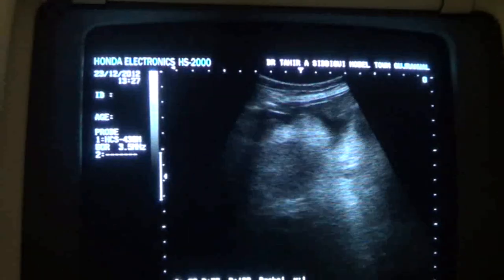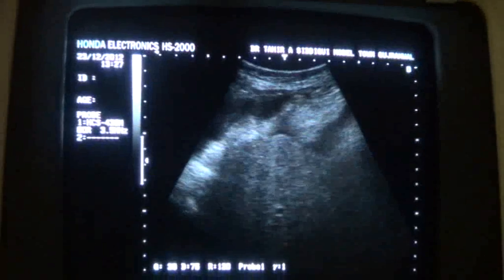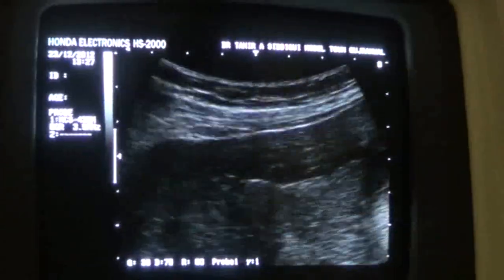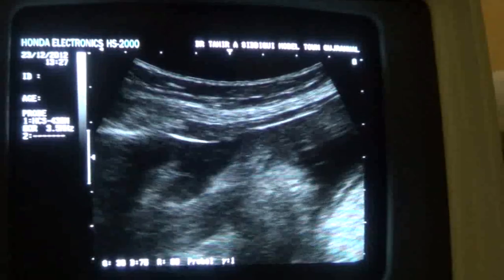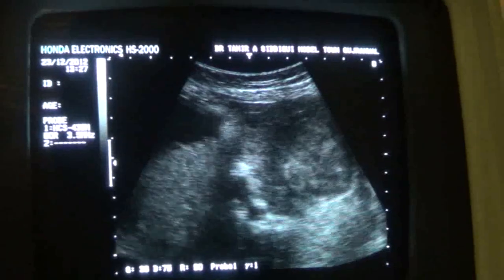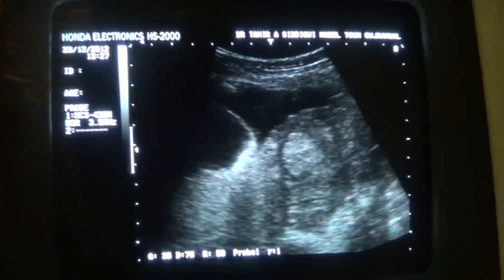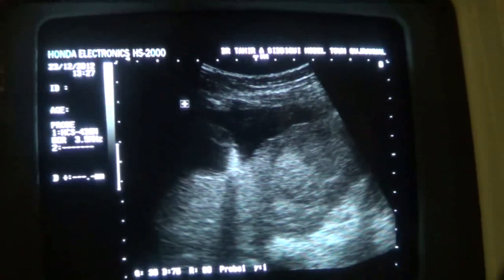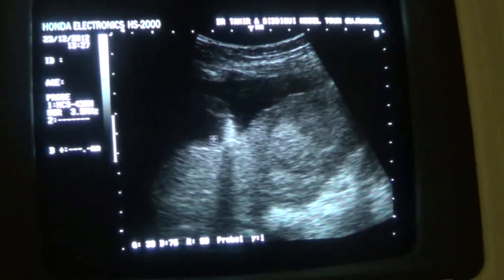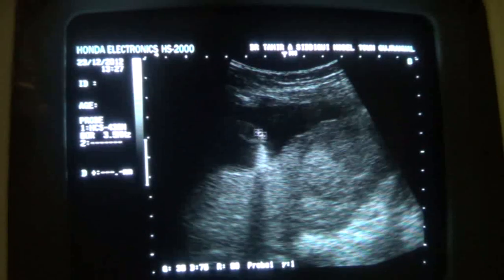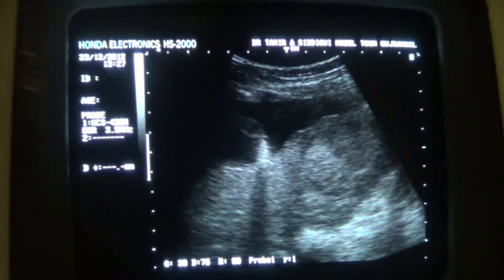This video segment relates to the study of a structure that dances in the ascitic fluid. This is the falciform ligament, and as you can see in the ascitic fluid, this is the liver. So this is the falciform ligament.